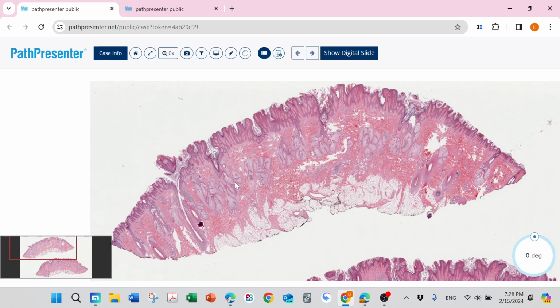What really catches your eye is this sebaceous gland. Usually a sebaceous gland is connected to the hair follicle, but this sebaceous gland is not. It connects to the epidermis, not the hair follicle. You can see it connects to the epidermis and then turns to the surface. And another feature from low power: you can see hair follicle, hair follicle, hair follicle, and then in all of this area we could not see any hair follicle, just kind of naked. That's the reason this lesion is kind of a hamartoma.